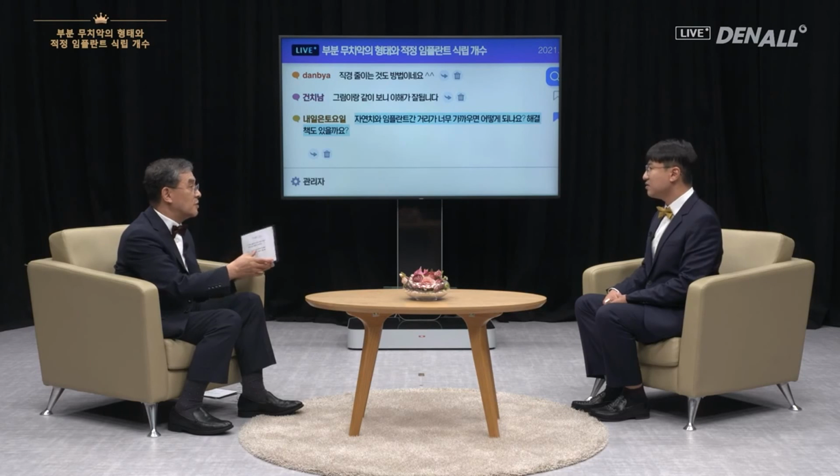Yes, and the anterior area, aesthetics is very important. If you place implants too close, aesthetically it can be challenging, and in the posterior area, we need to consider occlusal force as well. If there is space for implant placement, you should place it to address mechanical issues as well as biological issues.